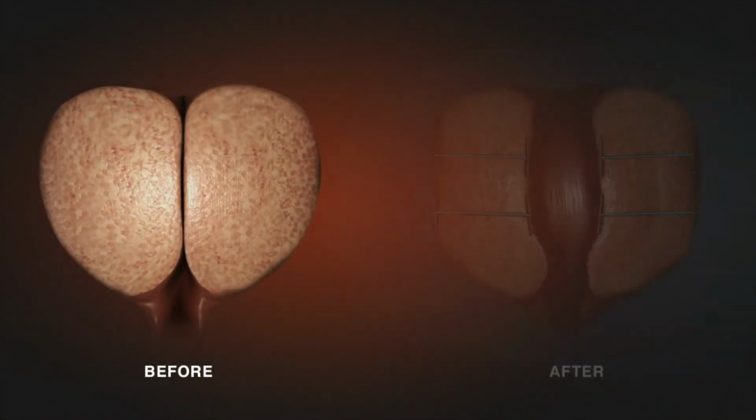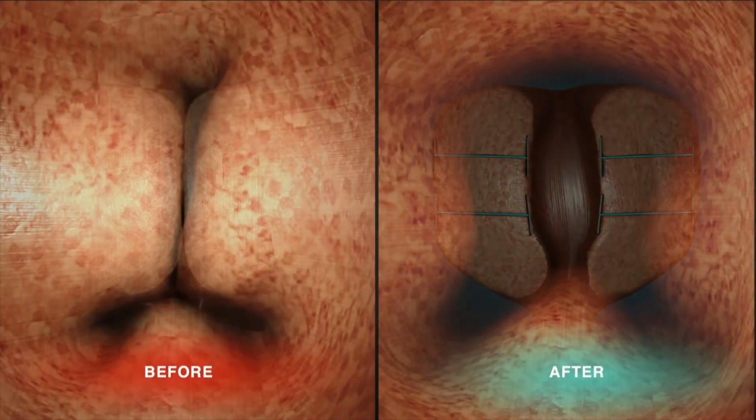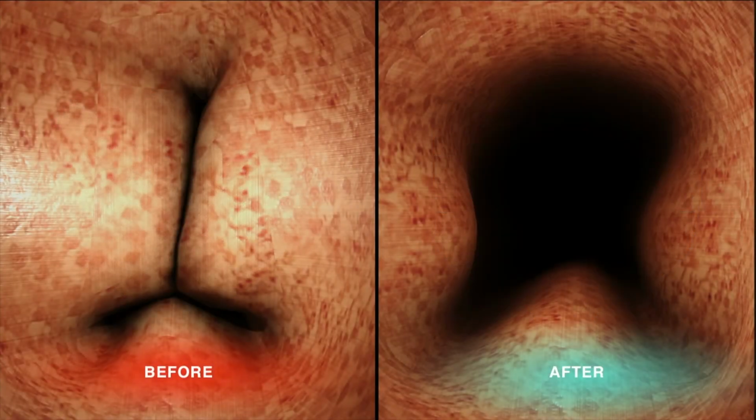These clips are permanent. They're not going to be picked up by any sort of metal detector or anything. They're inert, but there is some skill involved because you have to make sure the clips get in the right place, and you also don't want the clips to end up in the bladder, which can become a significant problem for the patients because you can get infections and stones and eventually need to get these clips removed.